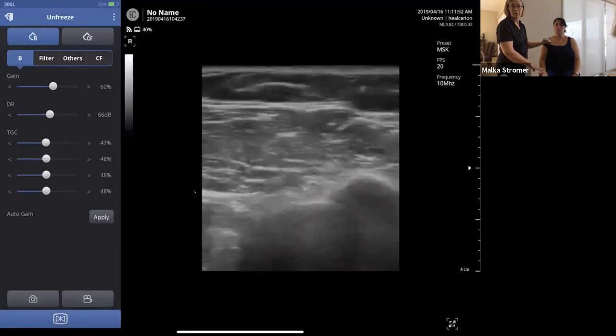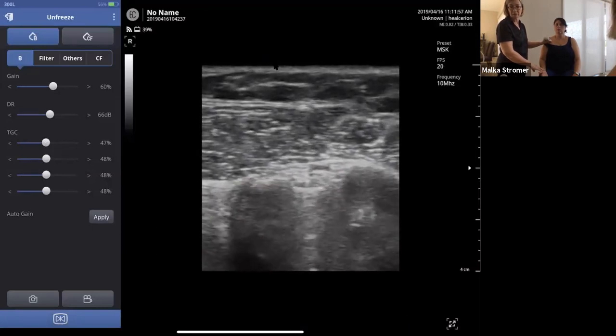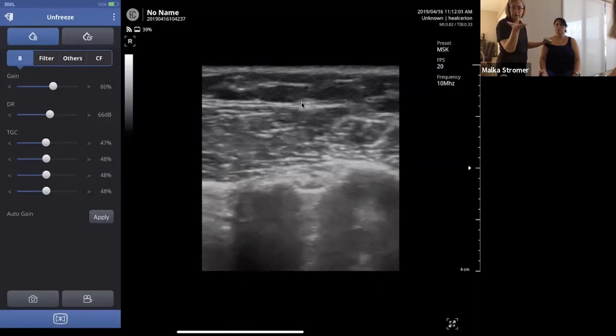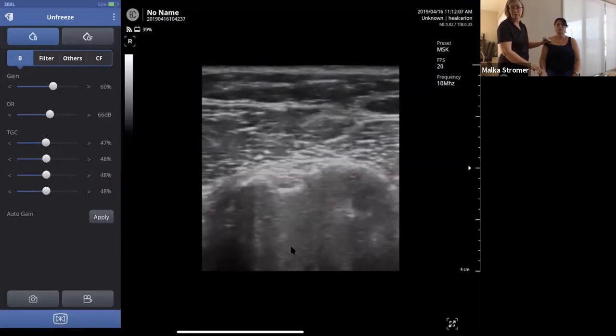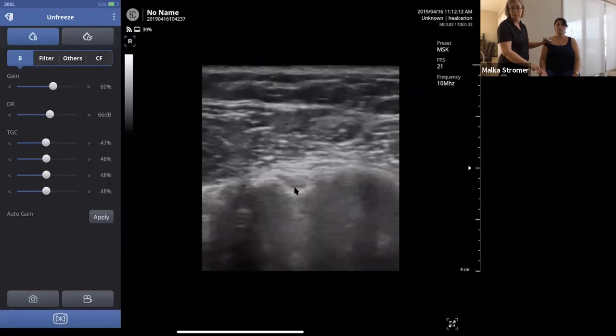All right, so once you're here, top of the screen is the skin surface. Below that is deltoid muscle. And again, we're taking a slice through the shoulder here. This is a cross-section or short axis view. The bicipital groove and the biceps tendon in the middle of the groove.